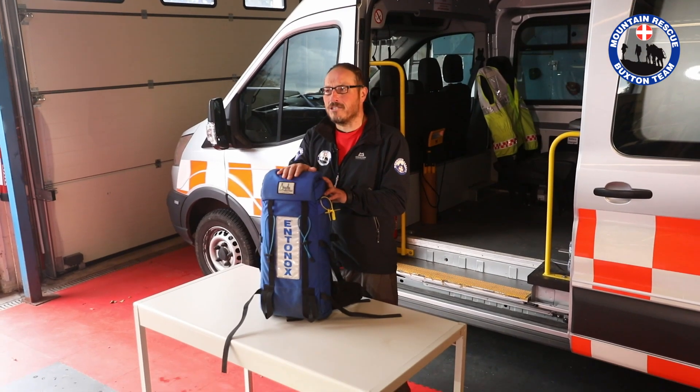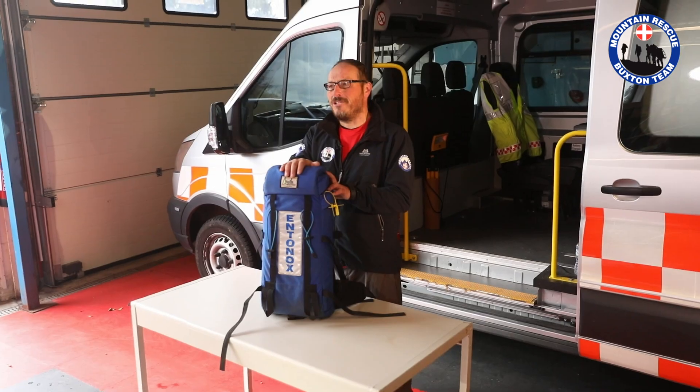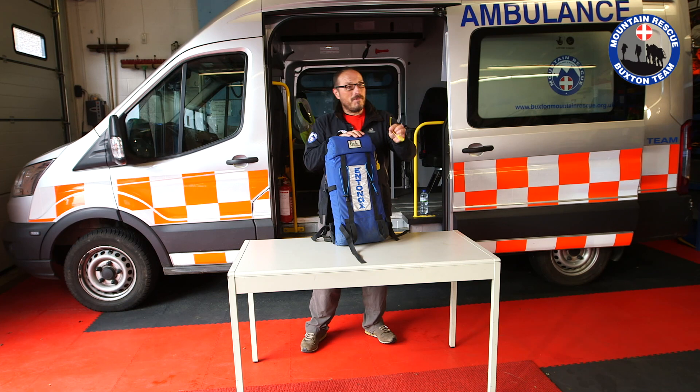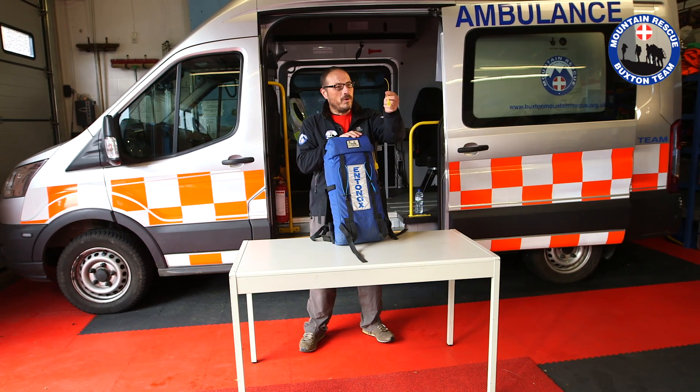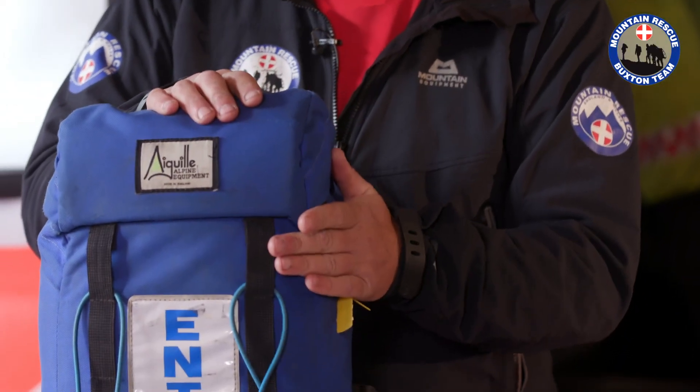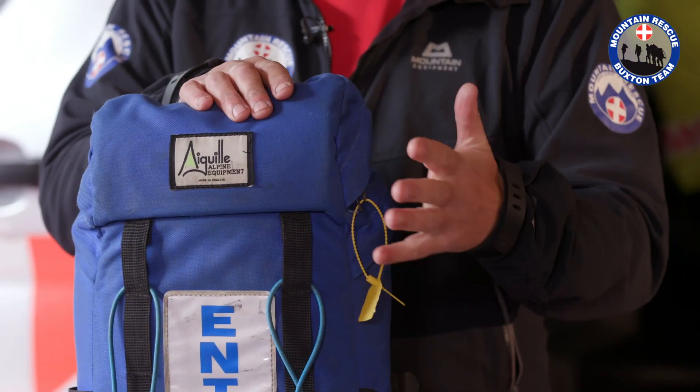And if we need to move you, straighten a broken ankle out or something like that, you're going to be very glad that this turns up. It's not an overly big bag, but it still does weigh around 10 kilos. Let's have a look inside. As you've seen on our other videos, we use these plastic tags everywhere to tell us — if I see a plastic tag on a bag, I know it's got in it what it's supposed to have in it and it's ready to go.